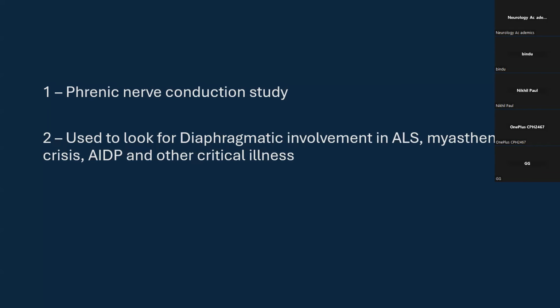There are many studies showing this. How do you know this is phrenic nerve conduction?